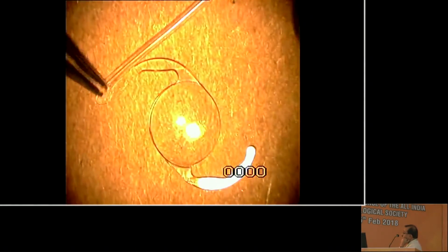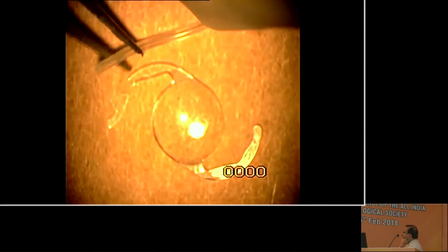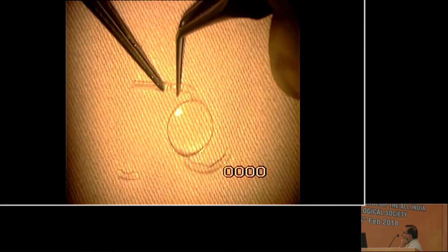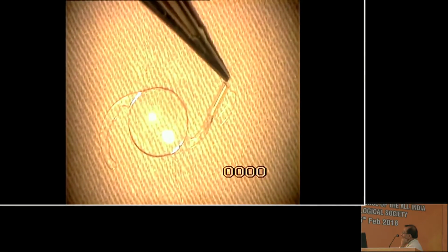Inadvertent fracture of the trailing haptic during IOL insertion is a regular problem. This would necessitate IOL explantation if the trailing haptic is fully cut from the optic. But if a stump of the trailing haptic is left, a silicone sleeve may be slipped over the stump after trimming it to size along its long axis to enable insertion of the same lens as is shown in this video.